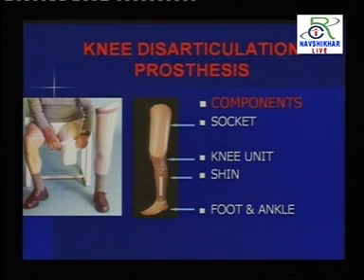So in this case the patient is free to walk with free movement, with some limitations, like squatting is not possible, cross leg sitting is not possible. These are some of the limitations in each and every prosthesis. But are they flexible enough to walk? For walking, yes.